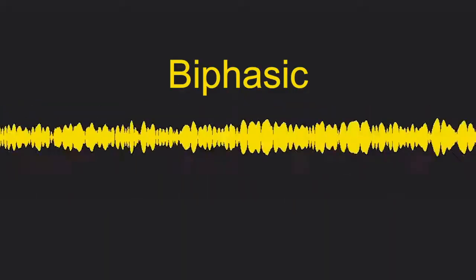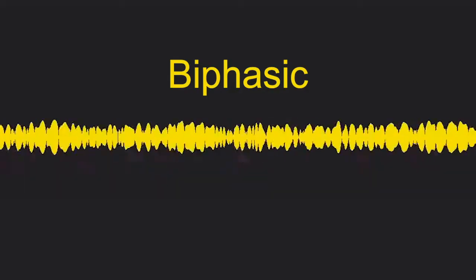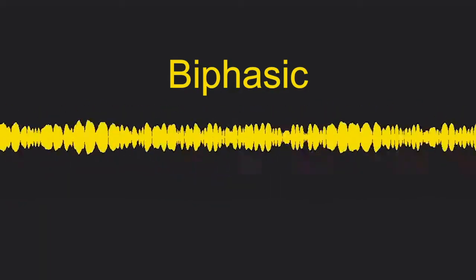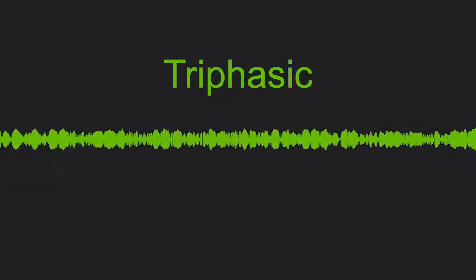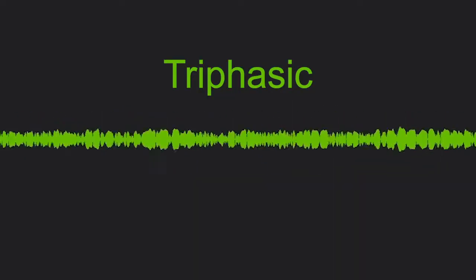Biphasic pulse: you will hear two beats per pulse. This is considered normal. Triphasic: you will hear a triple beat per pulse. This may indicate pulses are bounding and elastic, which can be normal or indicate high blood pressure.